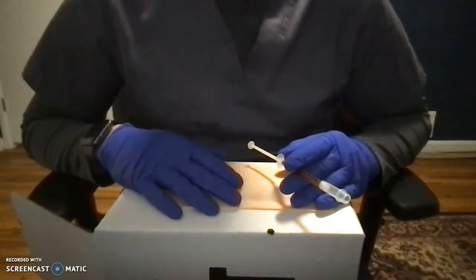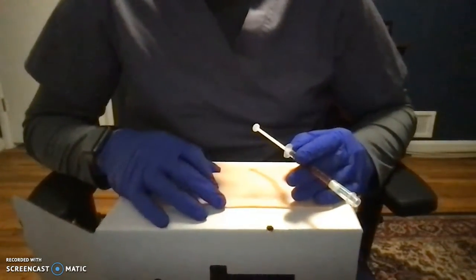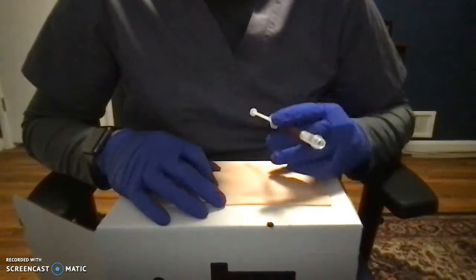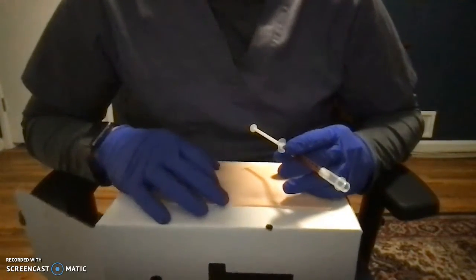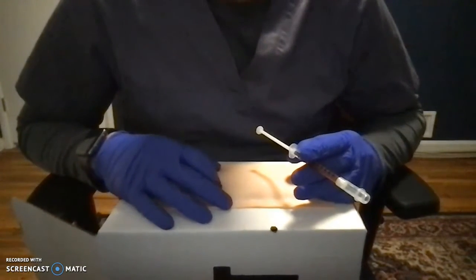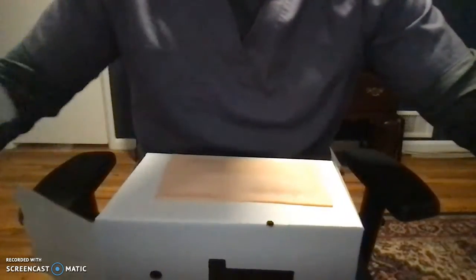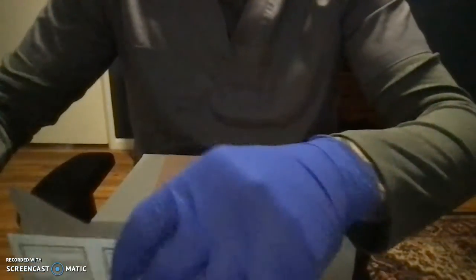So to make sure that the needle's the right size, we'd want to go ahead and pinch the skin. And you want the needle to be about half the size of the skin that you're pinching. So that would help you determine what size you're going to use. You'd basically measure the pinched skin that you have from top to bottom and go from there. We would then clean the site with an alcohol swab.